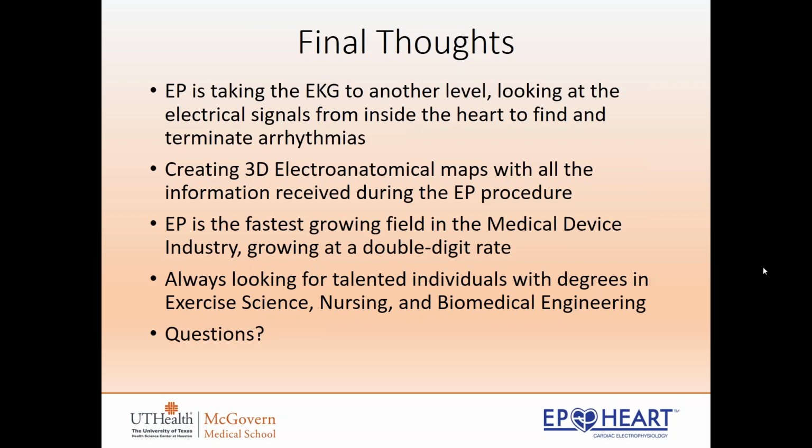Some of the more complex procedures, they will put the patients under general anesthesia, but then they just go and they put big IVs basically in your groins, and they will run catheters from your groin through your femoral vein up into the heart. So the only thing the patient really feels is like a stick and a burn, that lidocaine, just like if you were to go to the dentist.